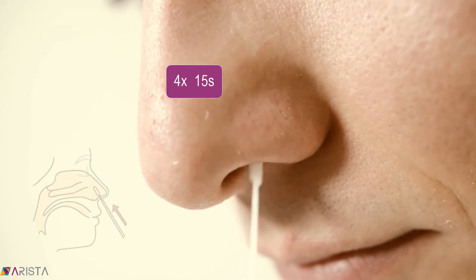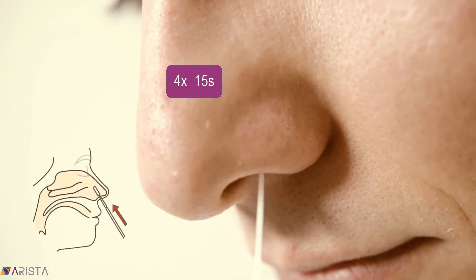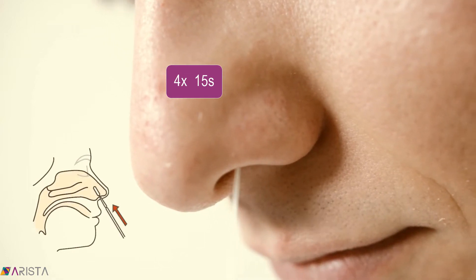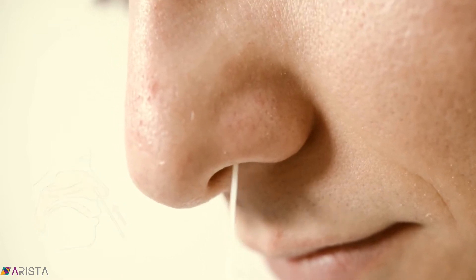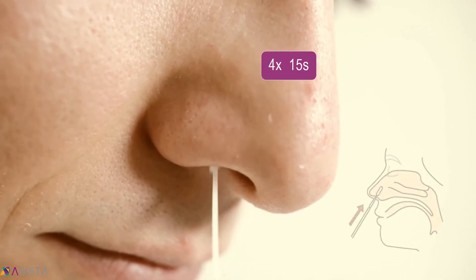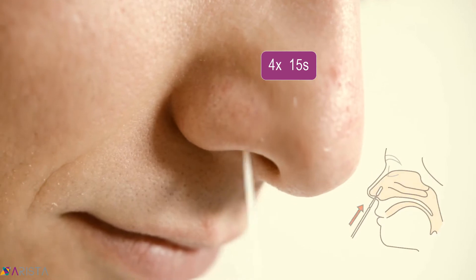Insert the swab sponge tip 1.5 cm into your nostril and slowly rotate the swab four times in a circular path against the inside of your nostril for 15 seconds. Use the same swab and repeat in your other nostril.